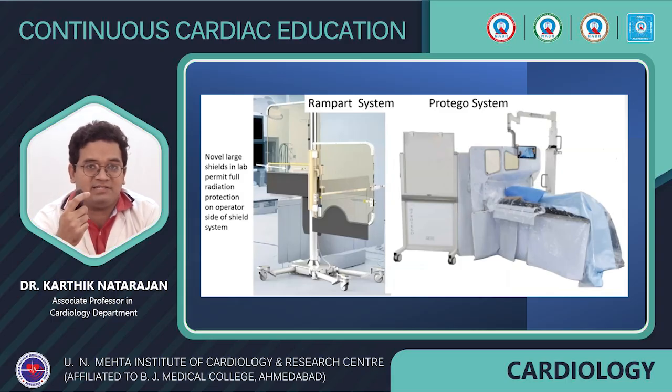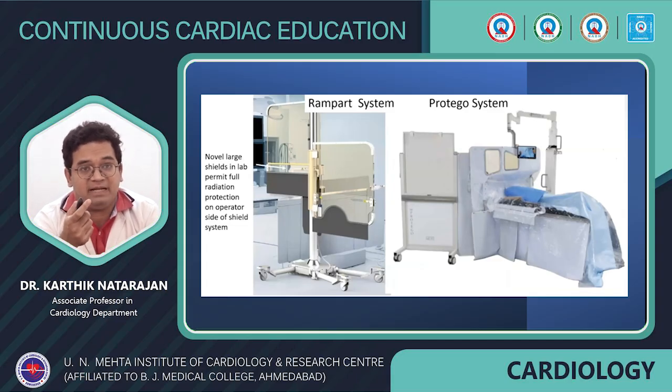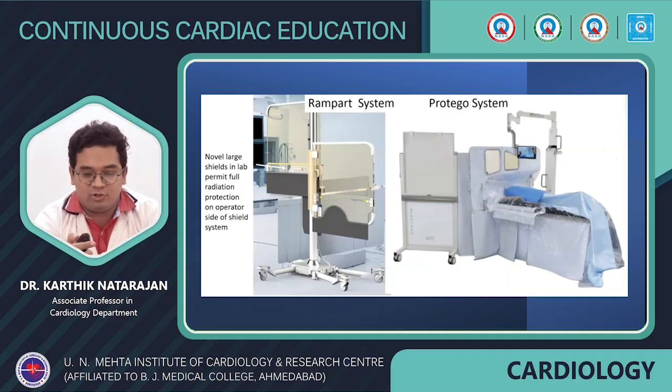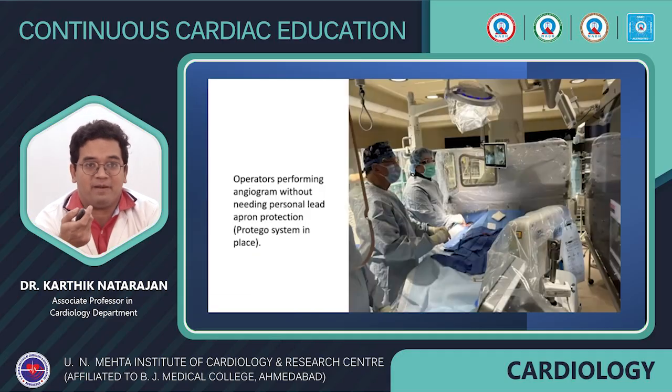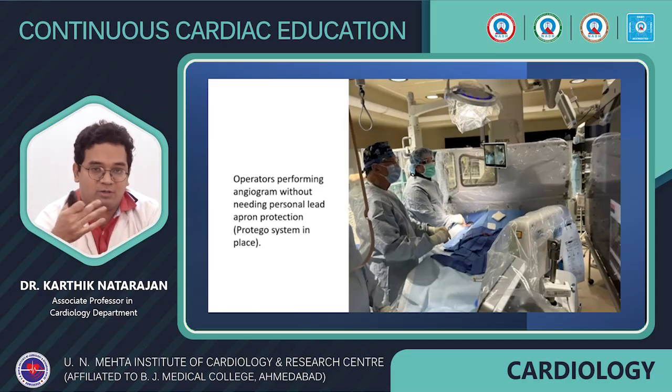Then you have the rampart system. Now this is the concept of going lead free. You also have the egg nest, where these shields will permit the operator from wearing any equipment. They don't have to wear anything, and I'll just show you how this works. So this is the operators performing the angiogram without even requiring the personal lead apron. So this is totally safe. Although the exposure to the patient would be there, the operators have no exposure at all. So this is a concept which has come into vogue, and nowadays more and more of the labs, especially the CTO operators, tend to adopt this rampart system.